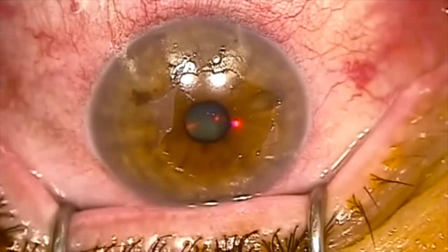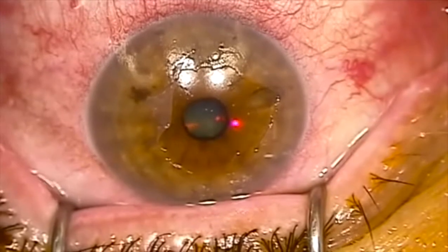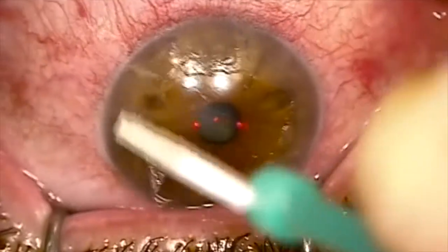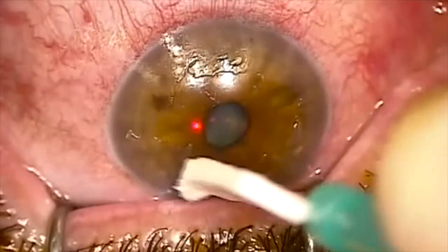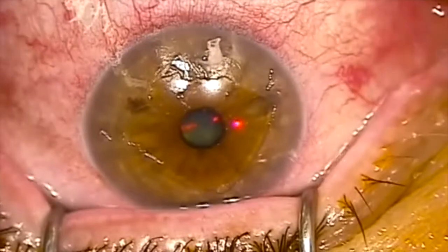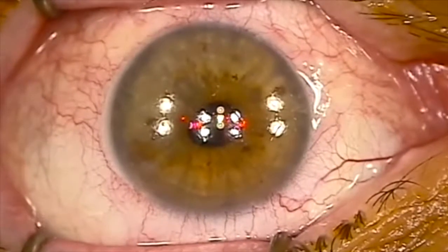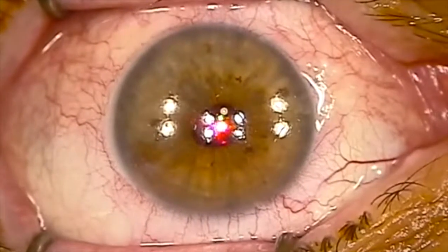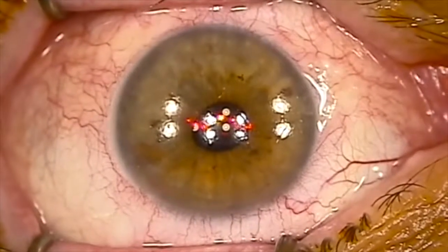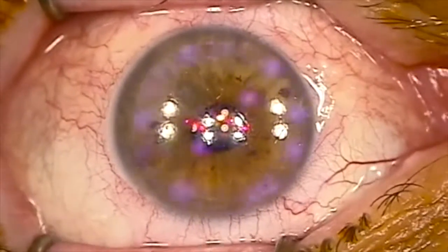I will always offer this procedure if I think it's appropriate or the best procedure for you, but not everybody needs to have the laser resurfacing procedure done with their collagen cross-linking, so I certainly won't offer it if it's not appropriate or needed. You'll see the laser is just about to start here — you'll see a red flashing light and some little purple dots moving across the cornea. That's actually the excimer laser reshaping this person's cornea.